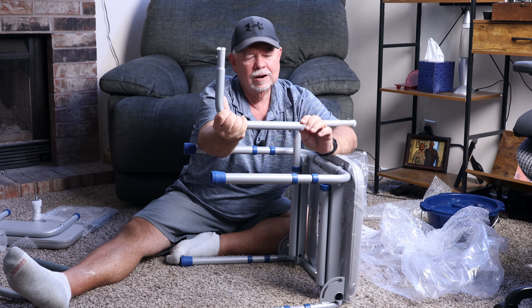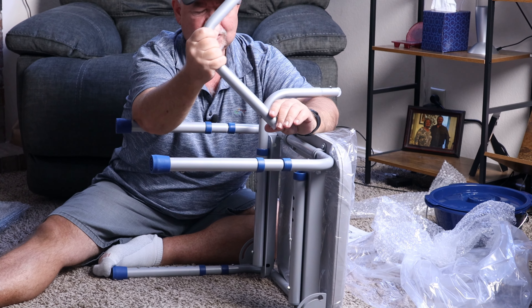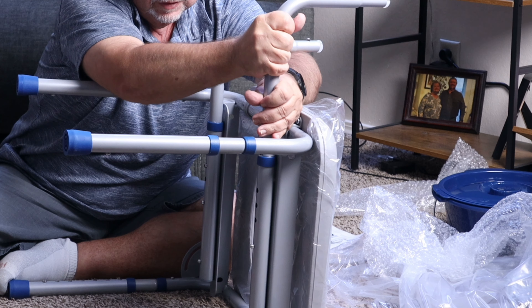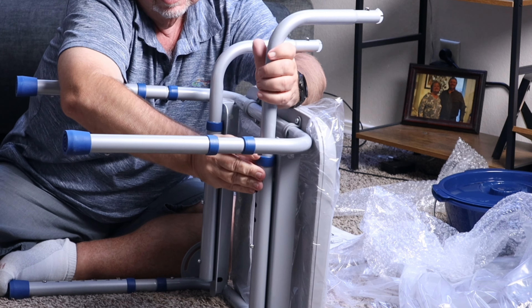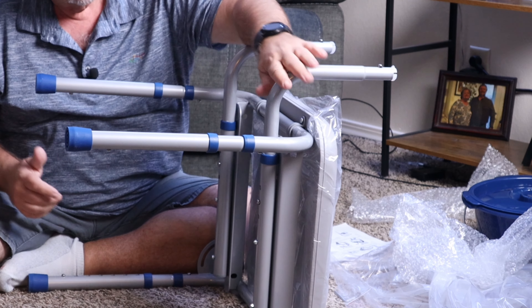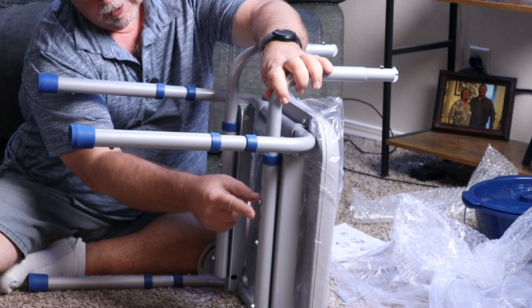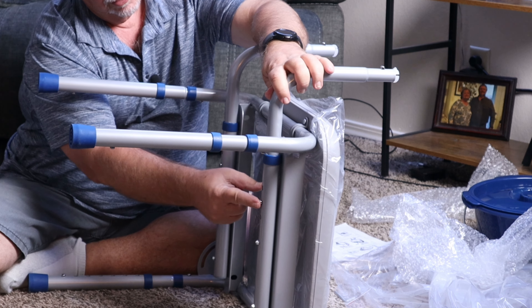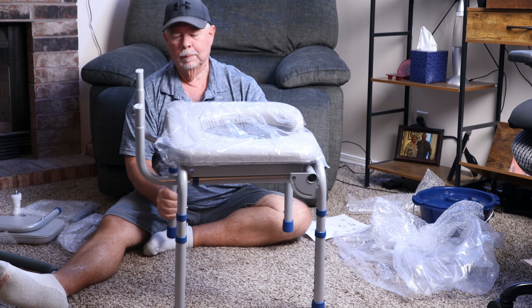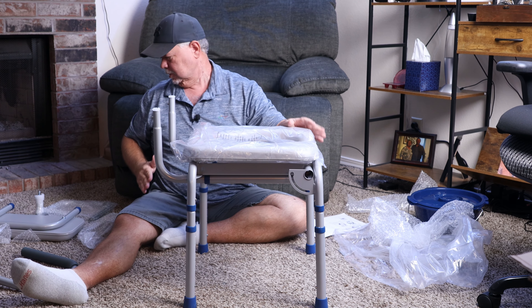It's got these plastic caps in there that kind of help take up the space — a little gap filler. Don't take those off; just work it, twist it, and it will go in. You just kind of have to work it in a little bit. Like I said, there are three different adjustments: first, second, and third. We're going to put it in the center hole right there.